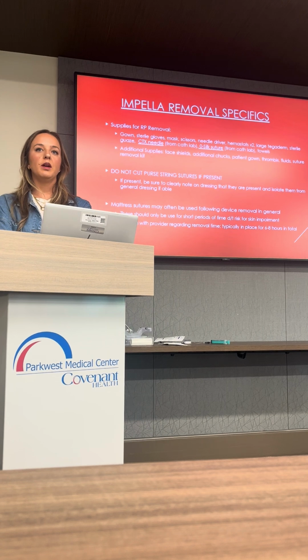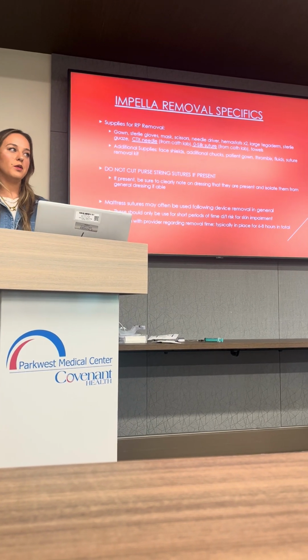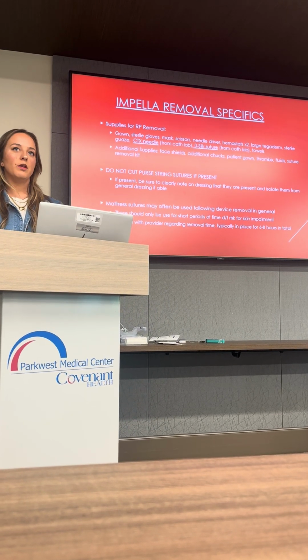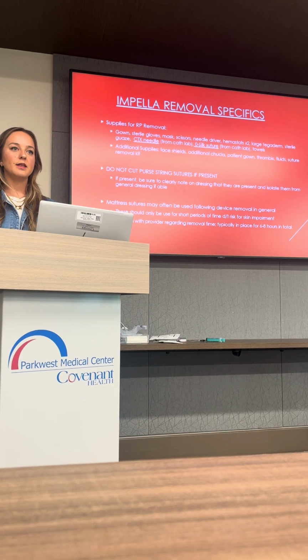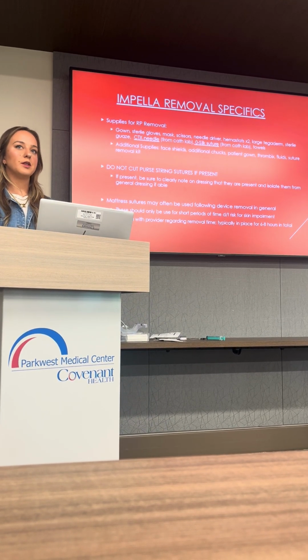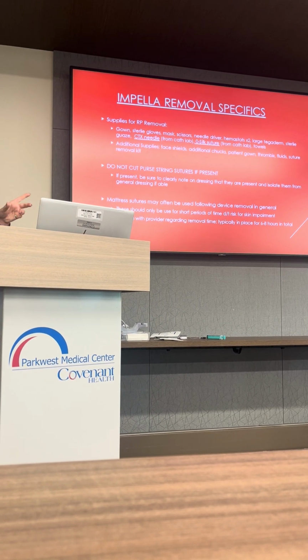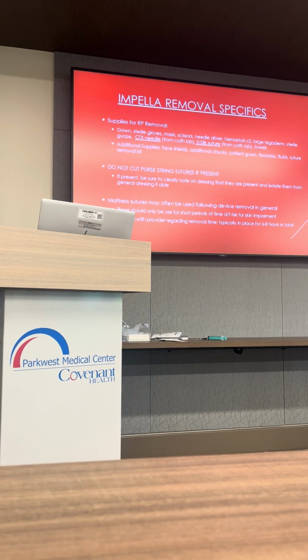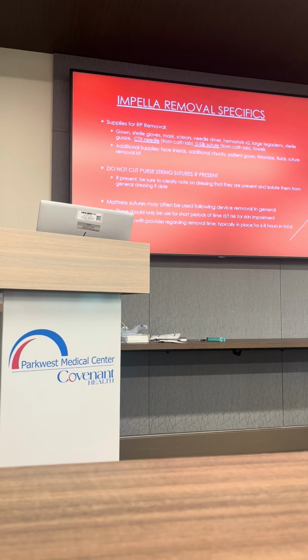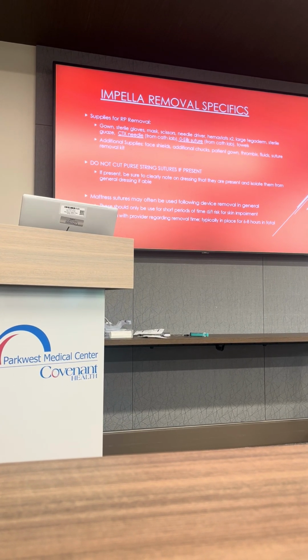And then another type of removal tool that we'll use is a mattress suture that can be in place. Typically, these are used for a short period of time if there's some oozing and different things like that. These are not something that need to be kept in for 24 hours or longer. This is something that will be very clear that we want removed in 6 or 8 hours, that you're wanting to check the site still, because this is a really tight suture that folds up the skin, and it can cause some skin damage or skin breakdown if we're not monitoring that area and keeping a close eye on it.